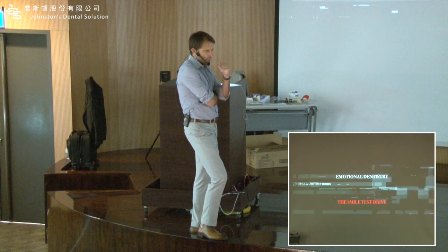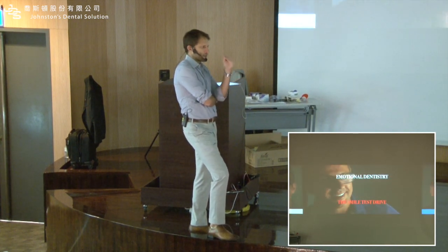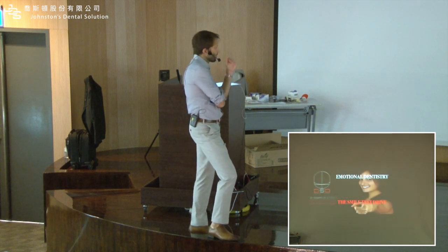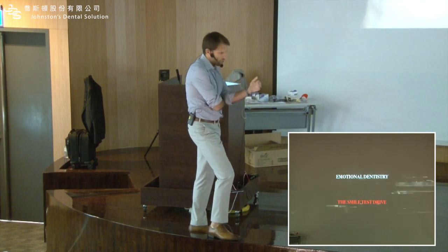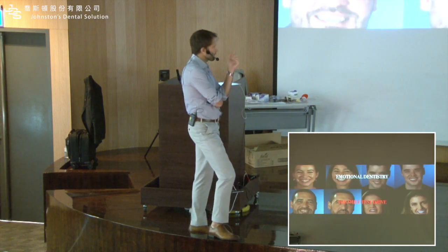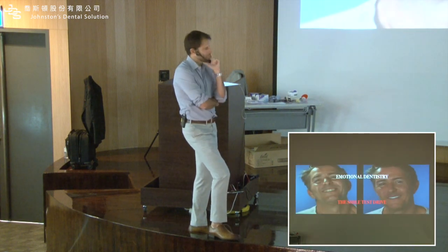The DSD treatment presentation strategy. You start with the mock-up, then you use technology to show all the findings and issues. Your intraoral scanner is your best partner on that as well. And then afterwards you present the treatment plan with the DSD presentation.